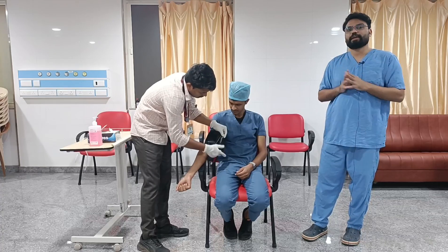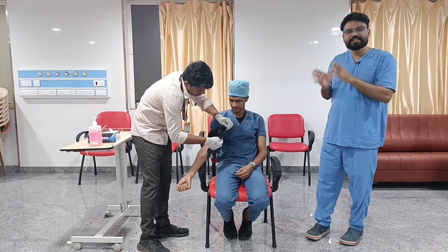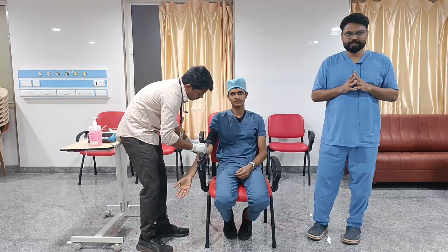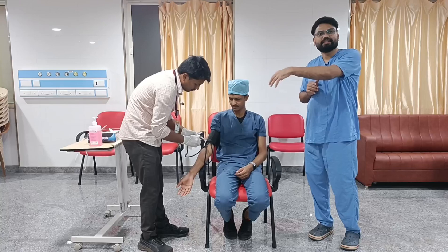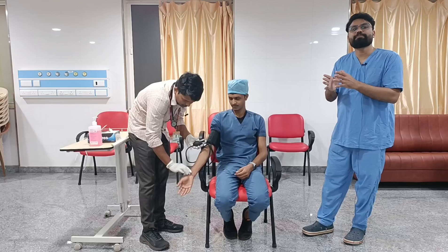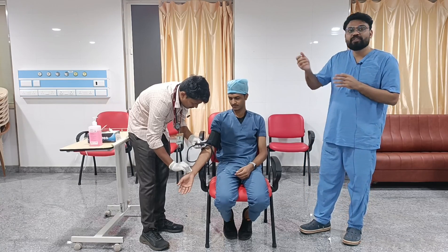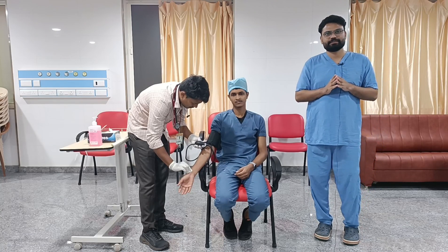Then we come to the third step: measurement of systolic and diastolic blood pressure. We use two methods — first the palpatory method, followed by the auscultatory method. In the palpatory method, we palpate the patient's radial artery and gradually inflate the cuff. At the point where we can no longer palpate the pulse, this marks approximately the systolic blood pressure. Then we gradually deflate at a rate of 2 mmHg per second.